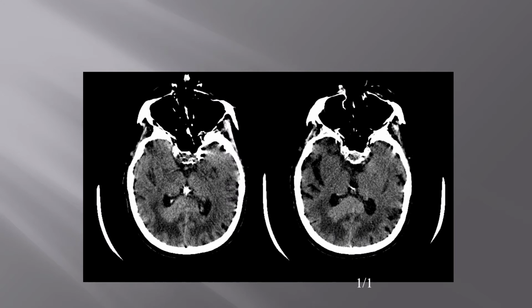Here's a CT image of the same patient. You can see the lesion is mildly hyperdense in the splenium of the corpus callosum and in the ependymal region. Surrounding it, there's lower density, that is vasogenic edema. So you often have a little CT hyperdensity in areas of tumors that have hypercellularity. And as you might guess, this was lymphoma.